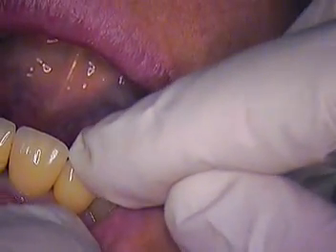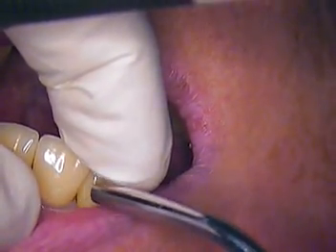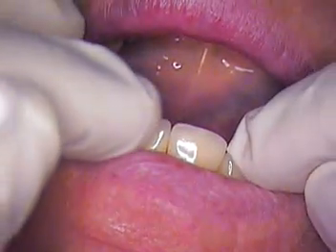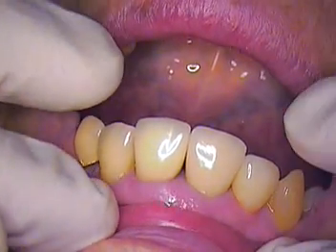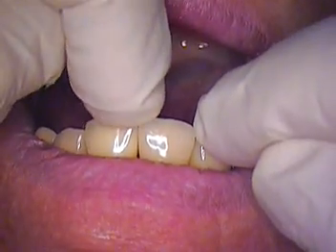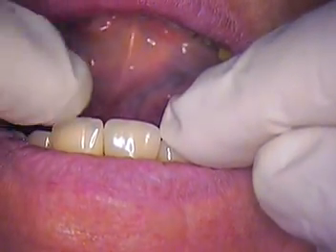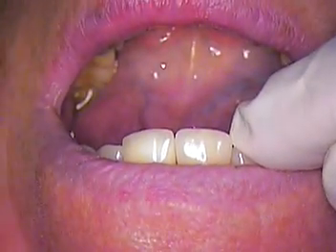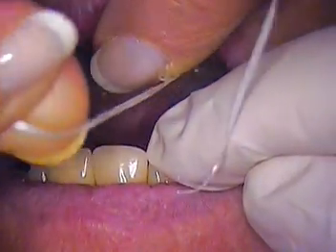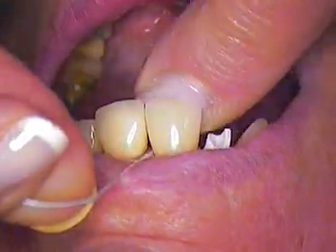It may feel a little tighter to you. Do you feel any tightness? So you did have a little bit of separation. Let's take a look at that with the scope. Alright, there's our new crown going in. Now let's go with floss right down the middle as I push and hold there — that's thin floss. Do you want to floss, Marsha, just to kind of get a feel for the middle, right down the middle of those two front teeth? Alright, right down the middle. Now I'm holding your crown in place — come through. Is that a decent contact now? I'm going to take the crown out and send the floss through again and see if that floats in there.